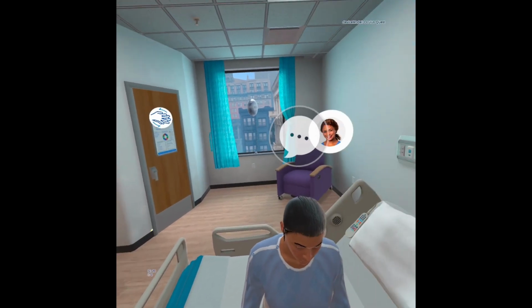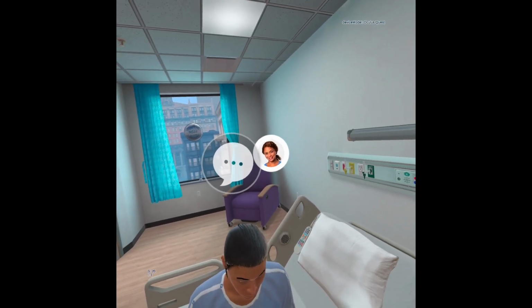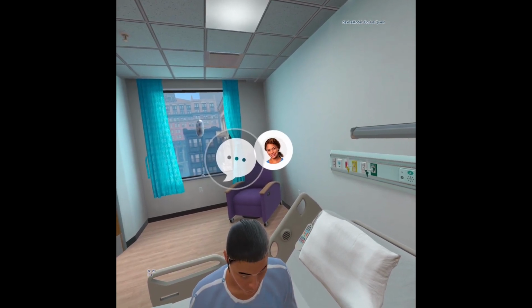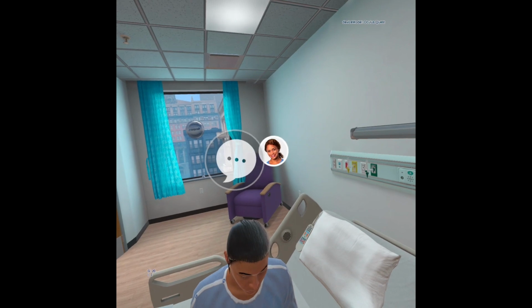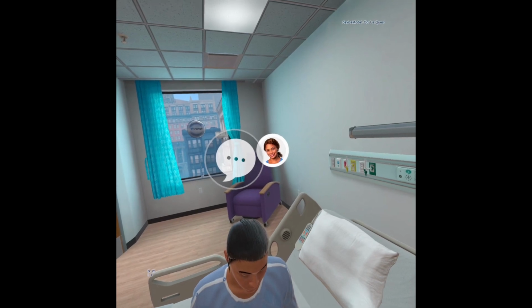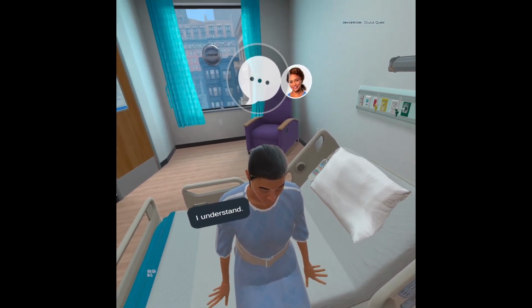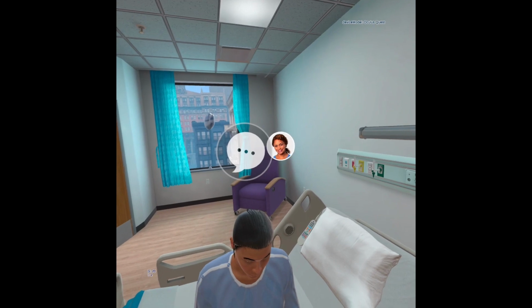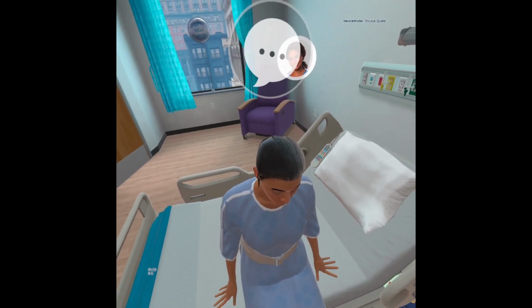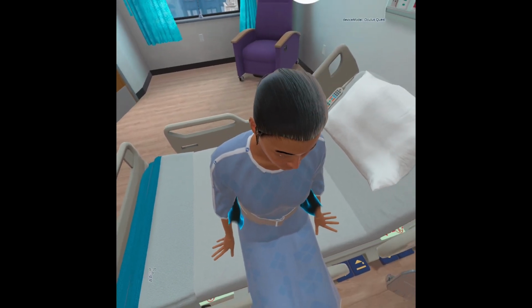Heather, we're going to have you rock back and forth 3 times before standing up. We'll be holding on to the gait belt to support you. On the count of 3, you'll use your arms to push up off the bed. We'll help you stand, then help you into the wheelchair. I understand. Move into the proper position. Yes. Now what? I'll count as we go.